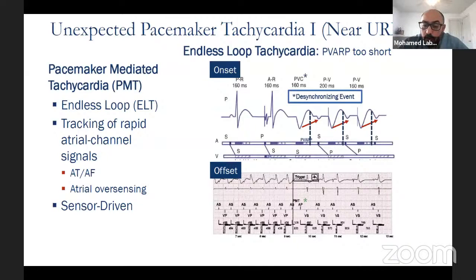As far as programming, obviously it's a totally different device. The way we're trained is we don't like to leave leads. So if it's a new device, we'll try to pull the pacer lead from the RV and put in the ICD lead.